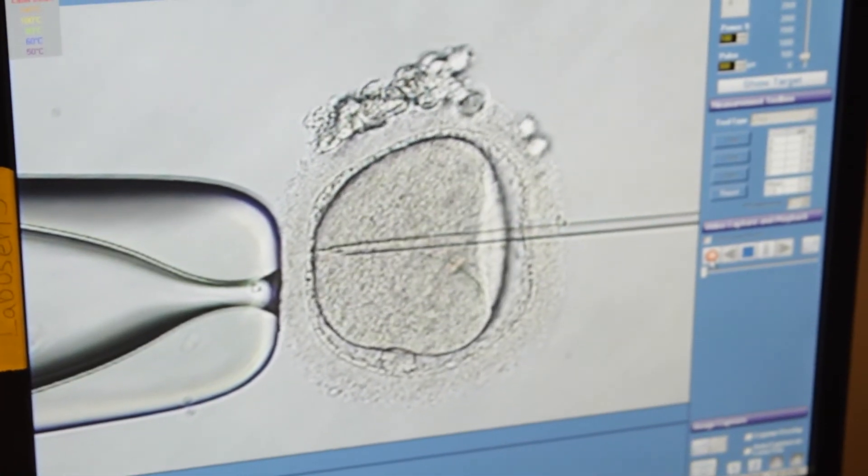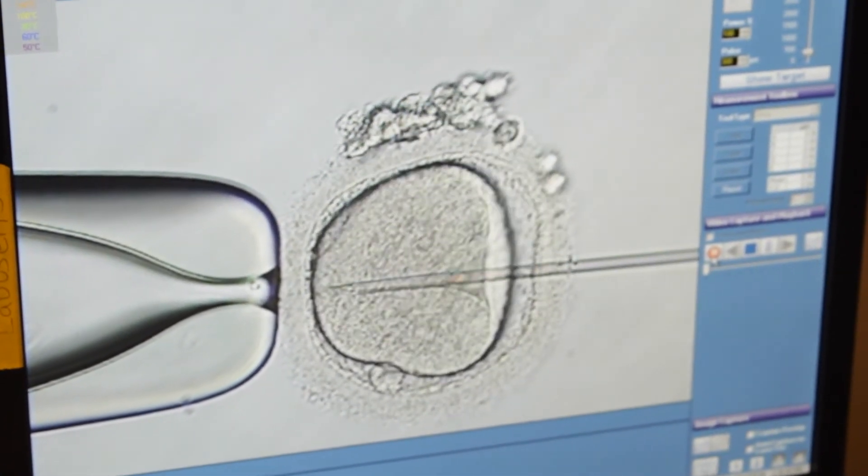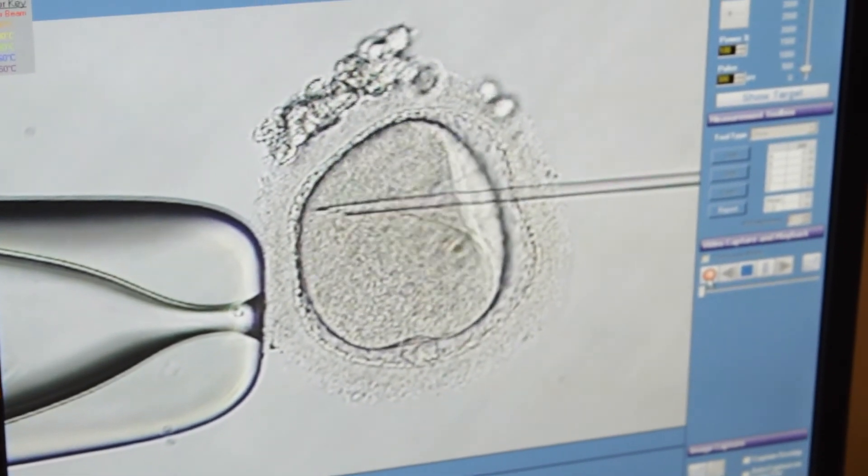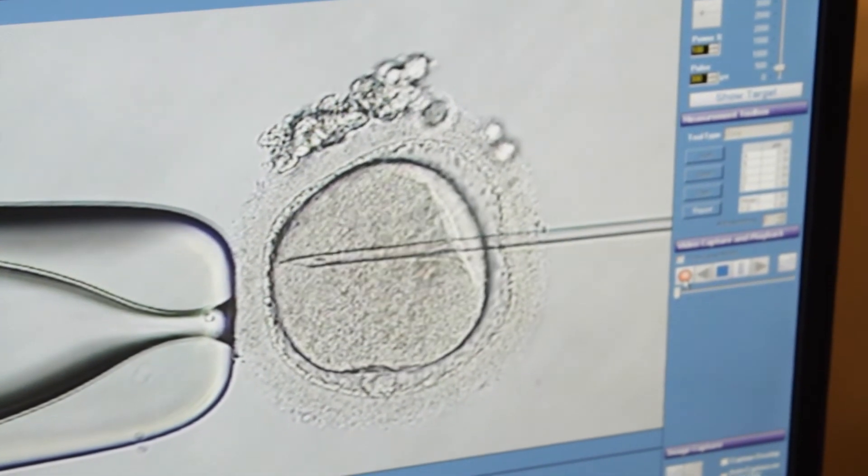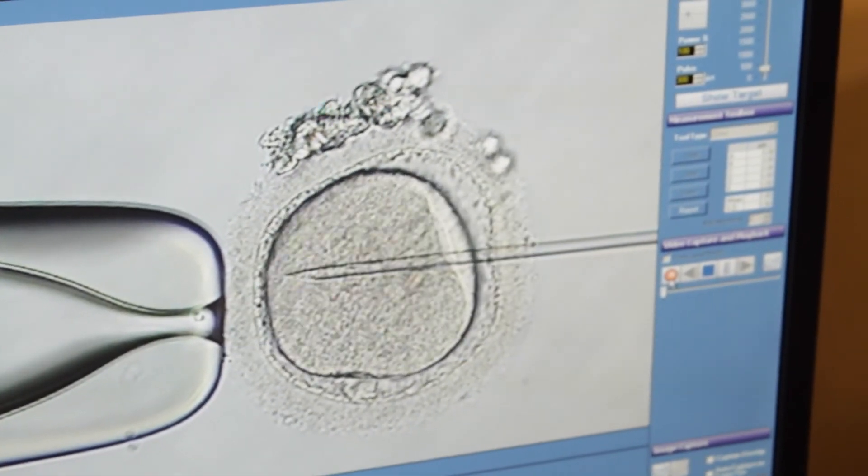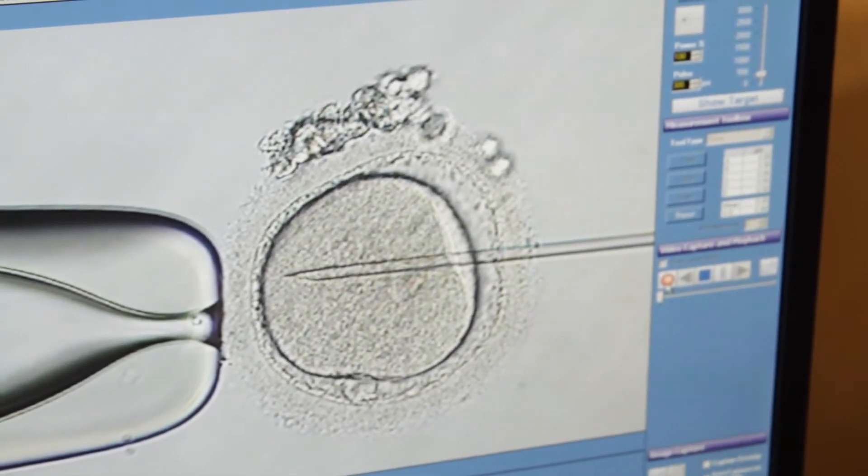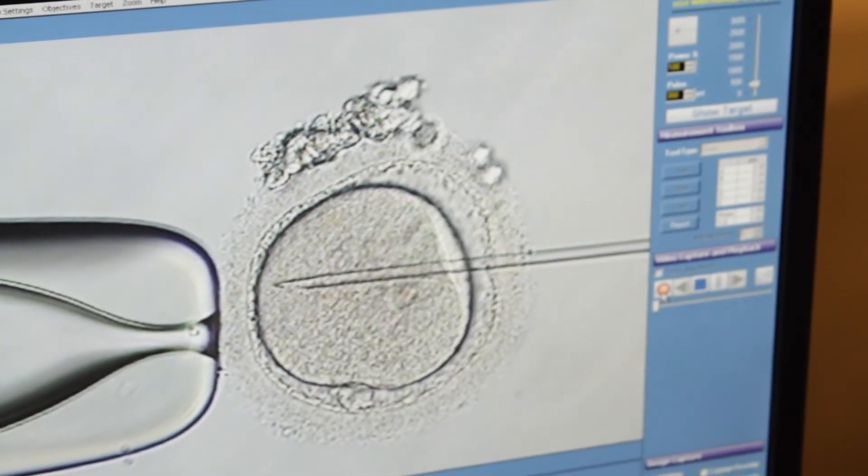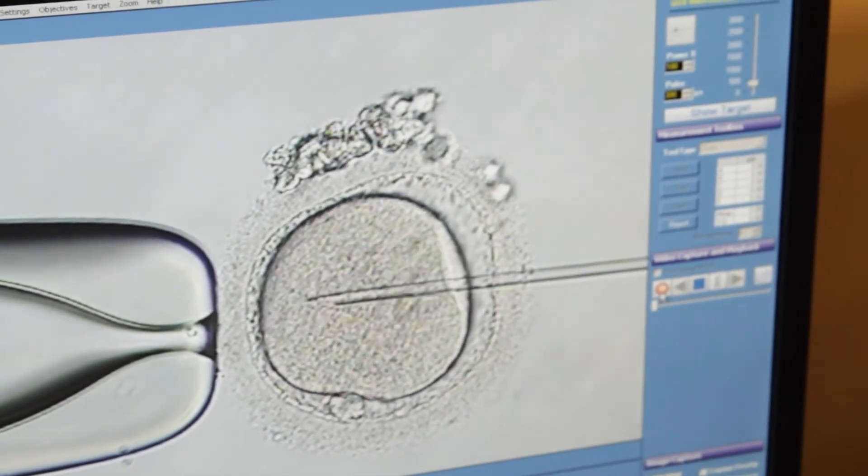Here at RMA of New York, we use a very gentle way of breaking the oolemma, which is the membrane of the egg, which is what Donna's doing there with the circular motion. We don't actually break it by sucking in the ooplasm, which is the standard method.